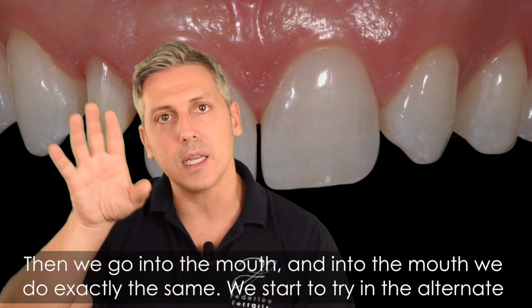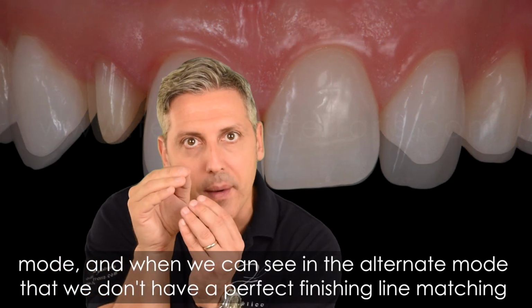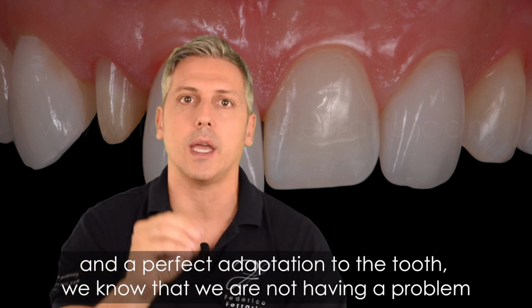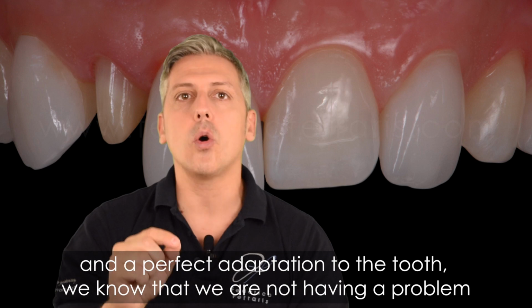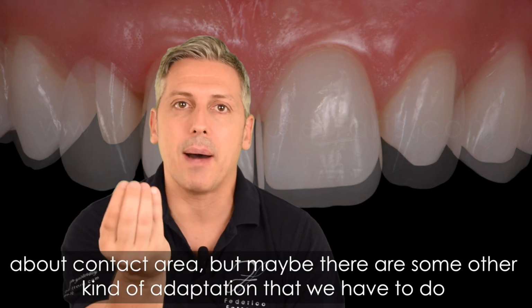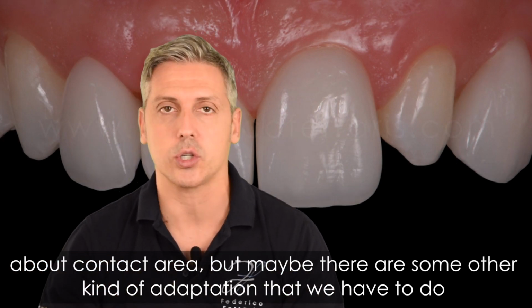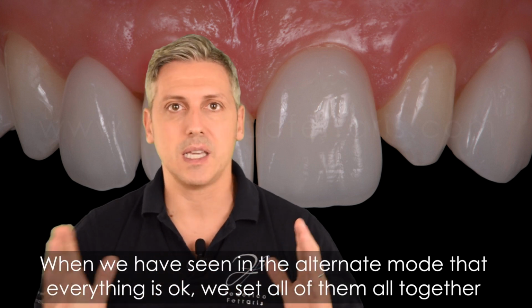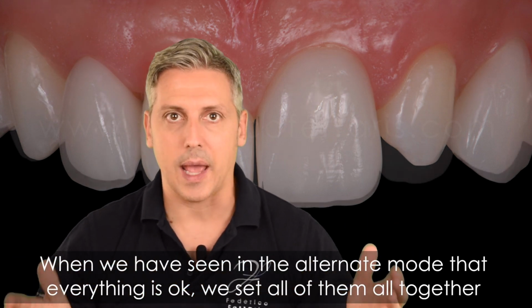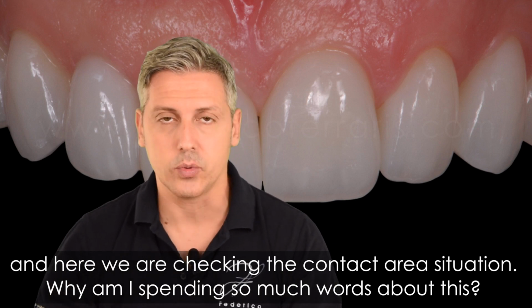We start to try in alternate mode, and when we see in alternate mode that we don't have a perfect finishing line matching and a perfect adaptation to the abutment, to the tooth, we know that we are not having a problem with the contact area, but maybe there is some other adaptation that we have to do. When we have seen in alternate mode that everything is okay, we set all of them together, and here we are checking the contact area situation.